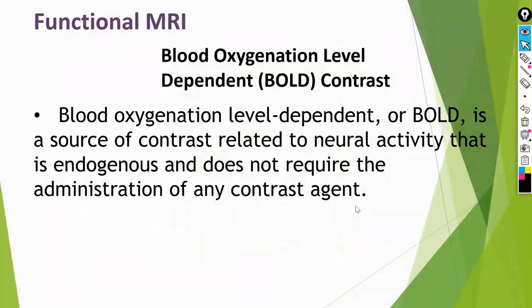What does it mean to work on an atom? What gives me the best signal in the patient's body? Is it the water molecule? All right, all the elements present in the body contain hydrogen, or most of the elements do, but for example, fat contains hydrogen and water also contains hydrogen.